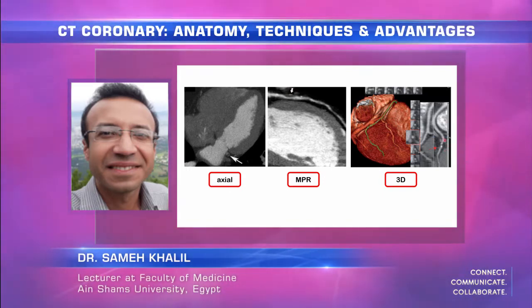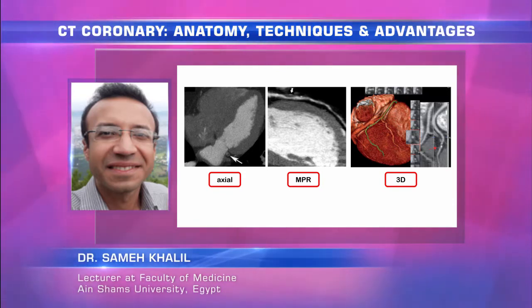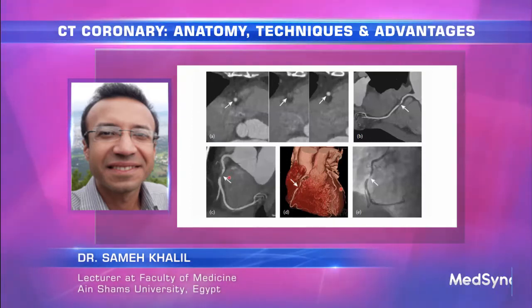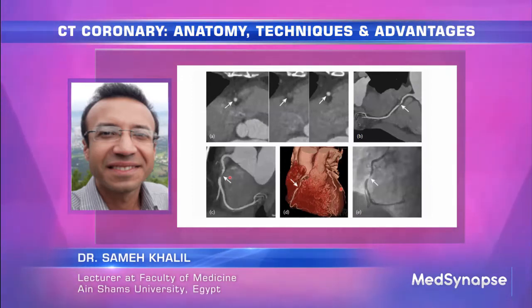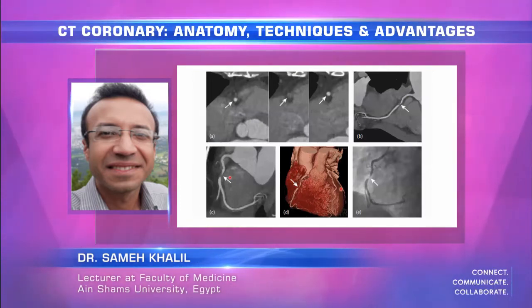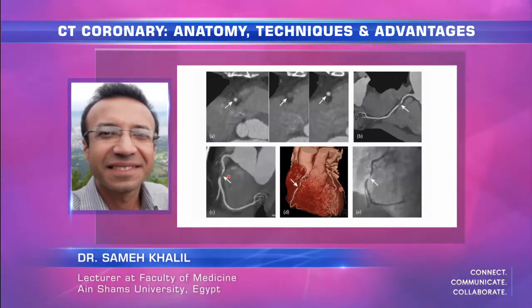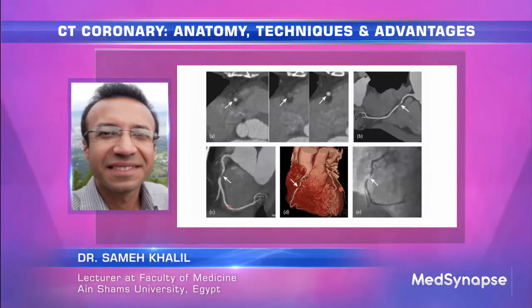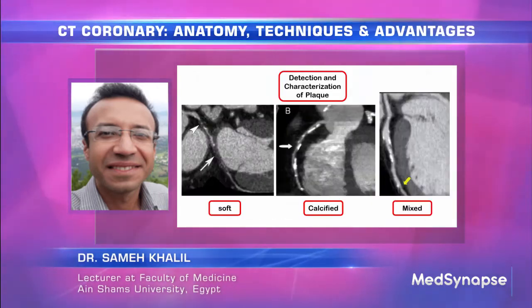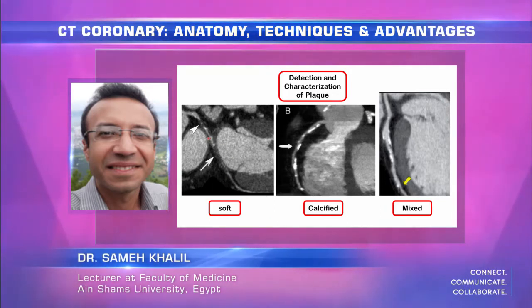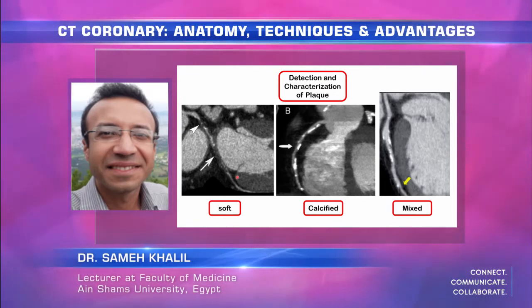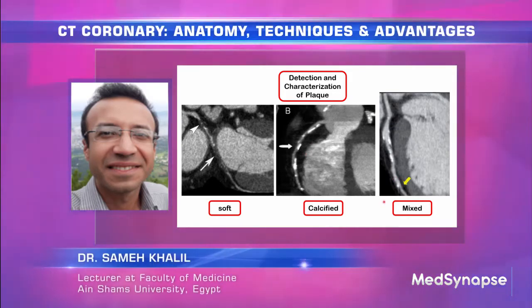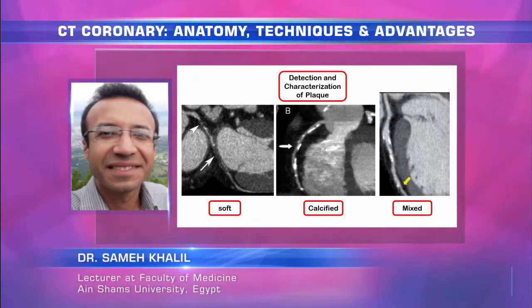This is another multi-planar reformat of a significant mixed plaque. Here we have a focal soft plaque with no calcified material, yet it is significant or totally occlusive. We assess the components of the plaque — whether calcified, soft, or mixed — the length, the severity, and the distance of runoff after the plaque. Soft plaques are more risky than calcified plaques.